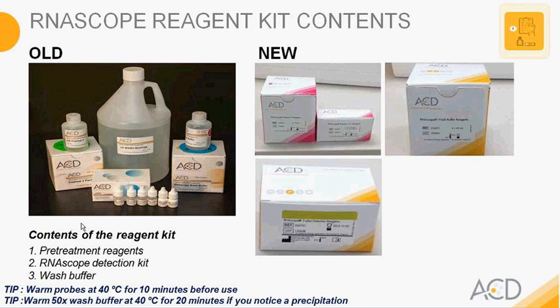For the probes, you should warm at 40 degrees for 10 minutes before use. And for the wash buffer, you should warm at 40 degrees for 20 minutes before use. These two reagents will typically precipitate either during shipping or during storage.